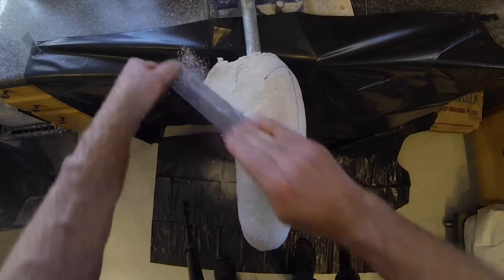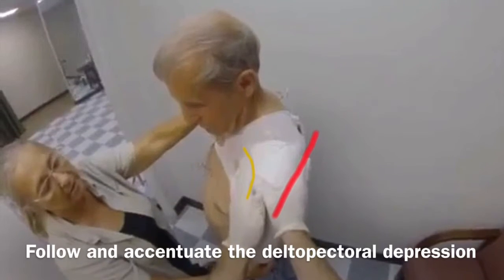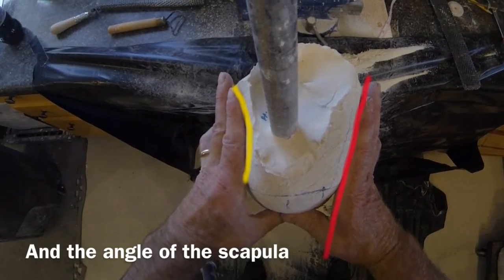The anterior wing will be reduced to the deepest point created during the casting of the residual limb. Follow the contours created during the casting in the deltopectoral region and the angle of the scapula.